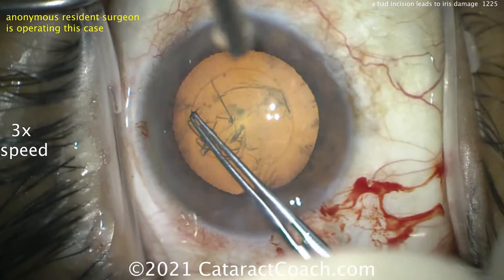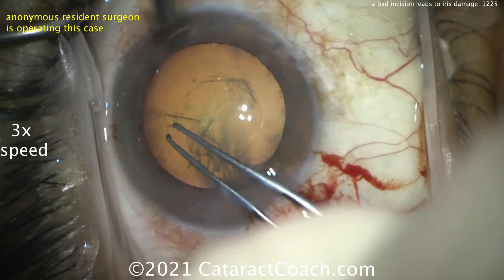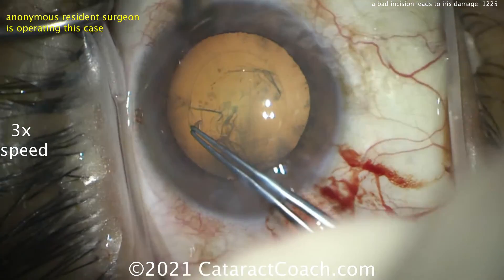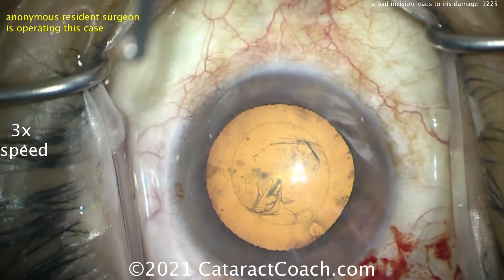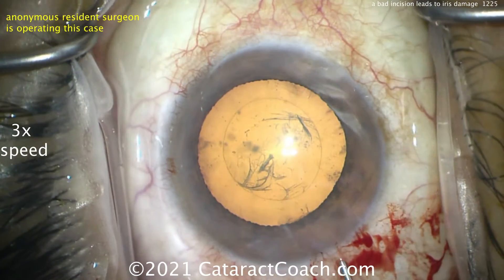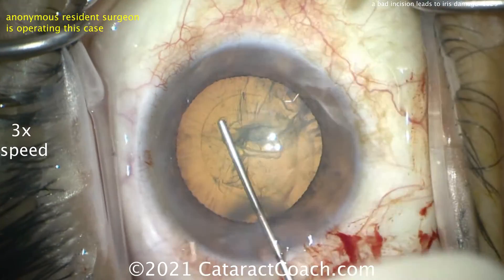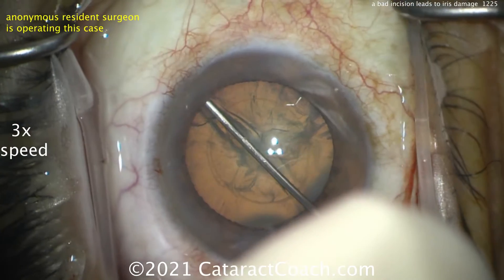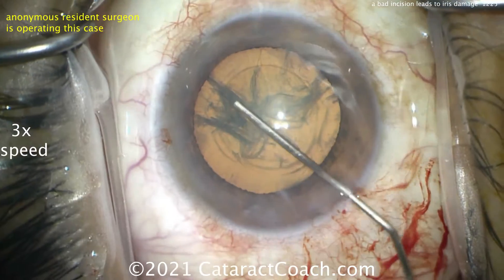What can you do here? You could get a little piece of a Weck-cell sponge and kind of wedge it into the side of the incision as you put the phaco probe in. You could try to put a suture to the side of the incision. You could increase your parameters — increase the bottle height or infusion pressure, and decrease the aspiration flow rate — to balance the inflow fluid versus the outflow.